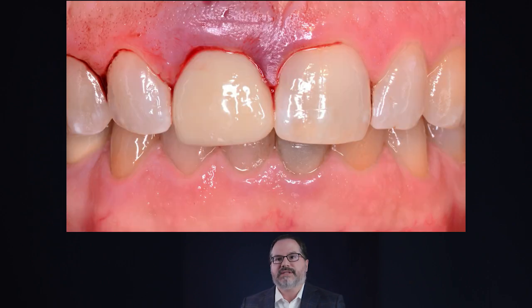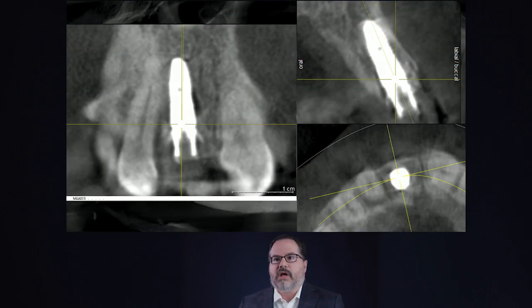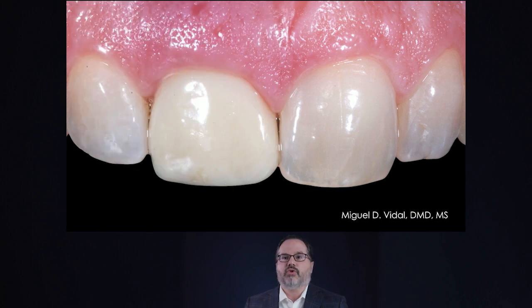And I simply need to place that in the mouth and make sure my critical and subcritical contours are not too bulky and make them flat. And this is how the patient leaves that day. We place the implant, and I show you how we are able to maintain that 2 millimeters of buccal plate to the body of the implant very precisely with digital guided surgery. And this is how the patient presents for her 2-week follow-up.